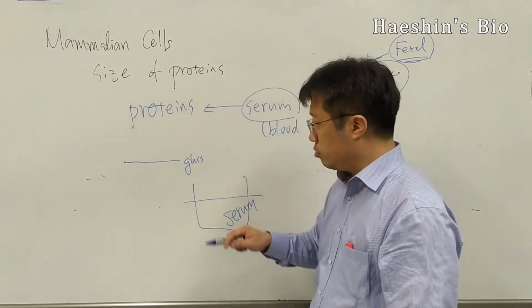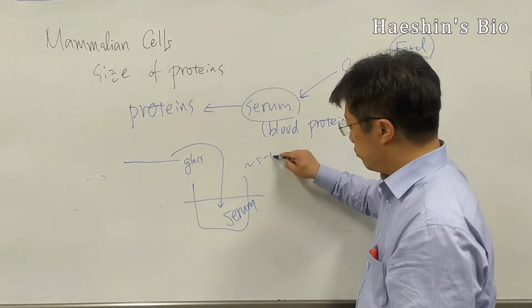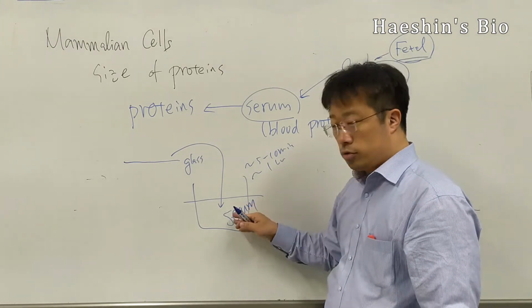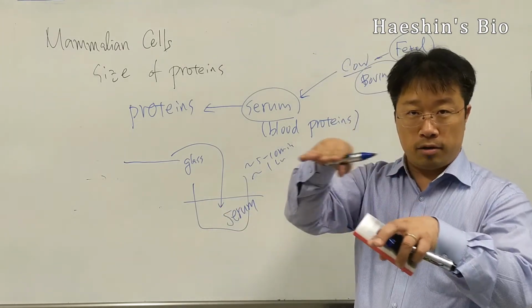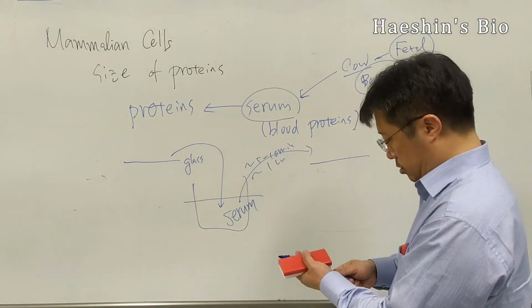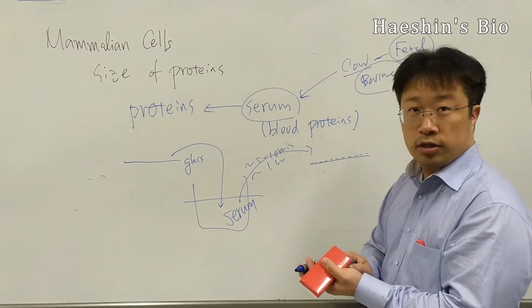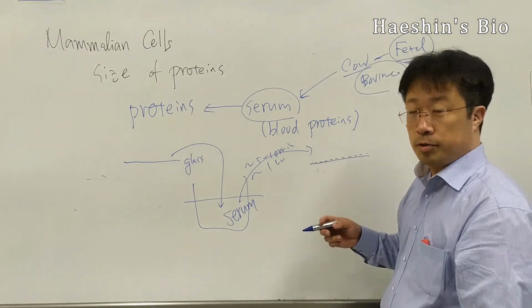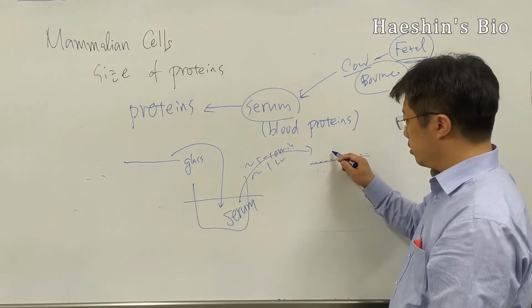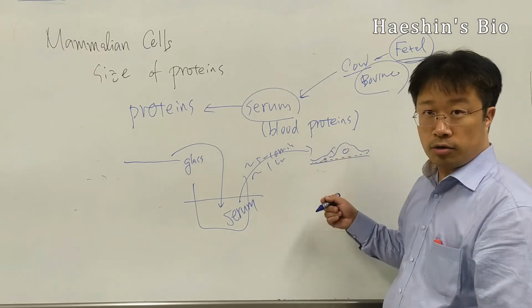You prepare the serum solution. The glass goes in here, maybe 5 to 10 minutes, maybe 1 hour. Then proteins absorb on top of the glass. You take it out. You cannot distinguish it, by the way, it's still very transparent, a few nanometers in thickness. Then cells can recognize it and they can grow. Okay.